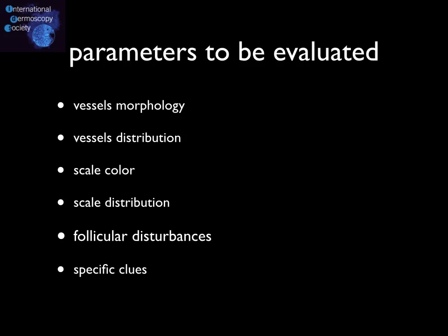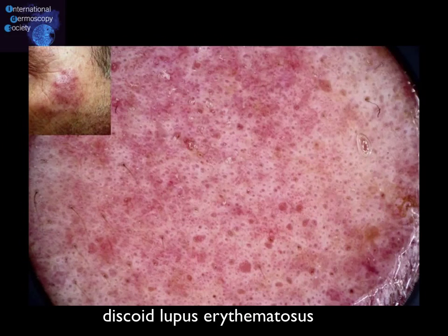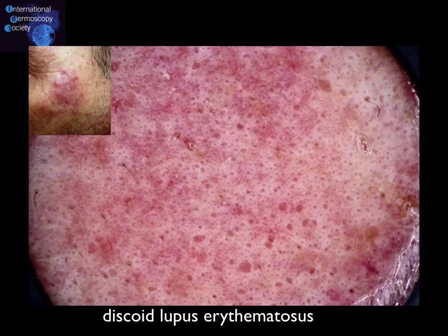Disturbances of the hair follicle are also important criteria in a subset of diseases, with a characteristic example being discoid lupus erythematosus. At its early stages, the most common dermoscopic criterion is a whitish halo surrounding the follicular openings, which may or may not be filled with keratin plaques.